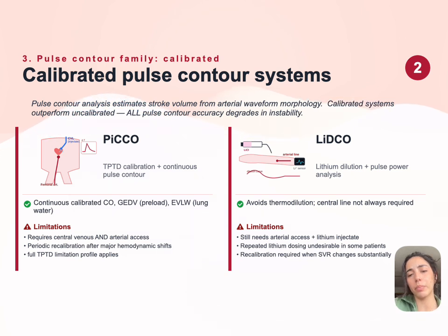the benefit to LiDCO, for example, is that you avoid thermodilution, and therefore you don't always require a central line. However, it is still invasive as it requires an arterial access, and you also have the added risk of injecting lithium into a patient. Obviously, repeated lithium dosage is not going to be desirable in some patients, and it's going to require recalibration when there are changes in systemic vascular resistance.